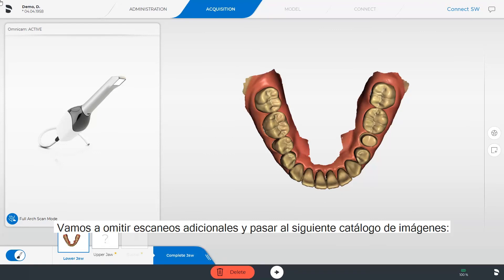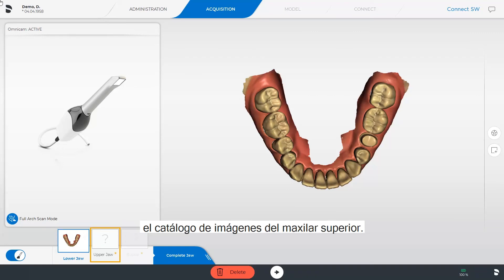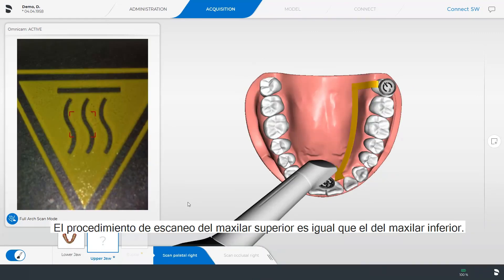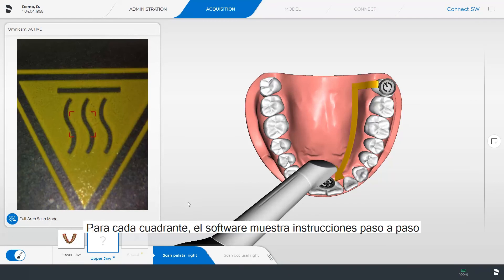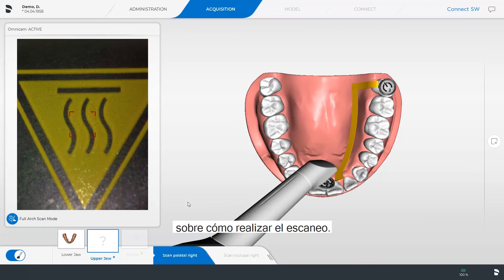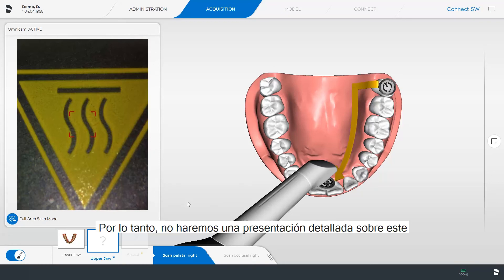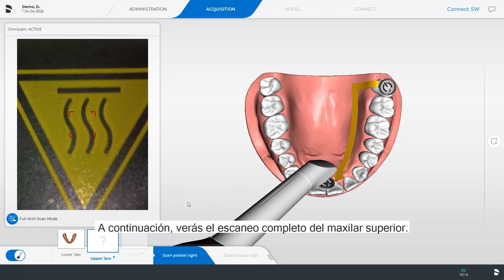We omit complementary scans and switch to the next image catalog, the upper jaw image catalog. The scan procedure of the upper jaw is the same as for the lower jaw scan. For each quadrant, the software displays step-by-step instructions on how to perform the scan. Therefore, we will skip a detailed presentation here and next you will see the complete scanned upper jaw.